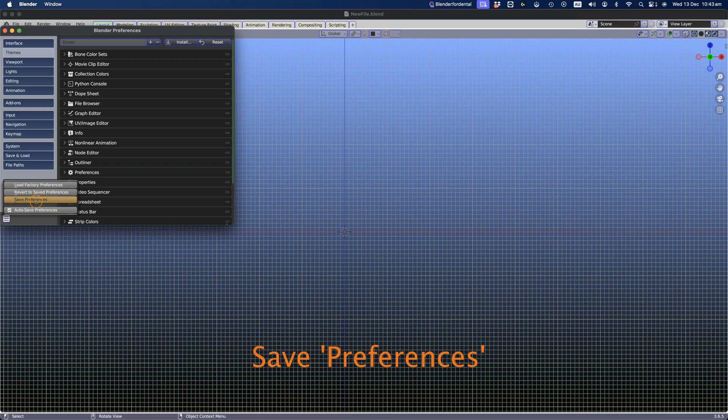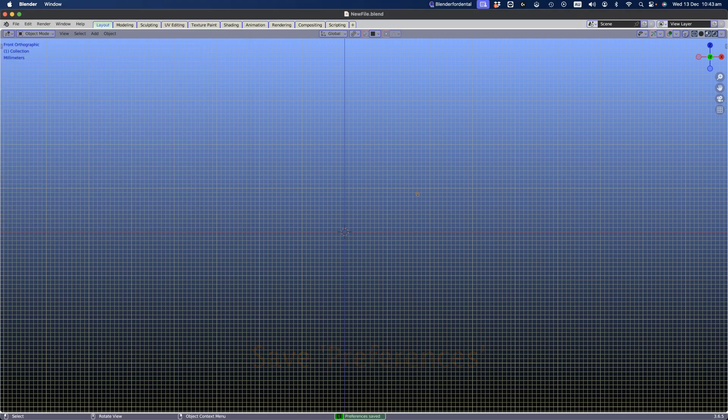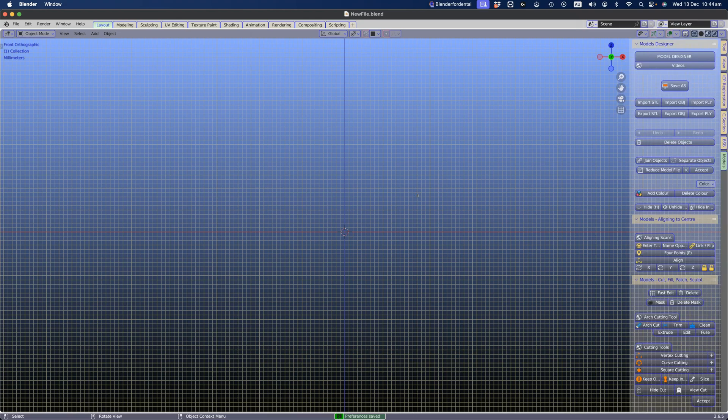Congratulations! You've successfully installed Blender4Dental software. Click on the viewport, press the letter N on your keyboard, and you should see the menu on the right-hand side.